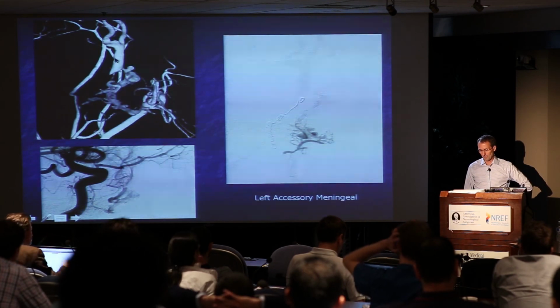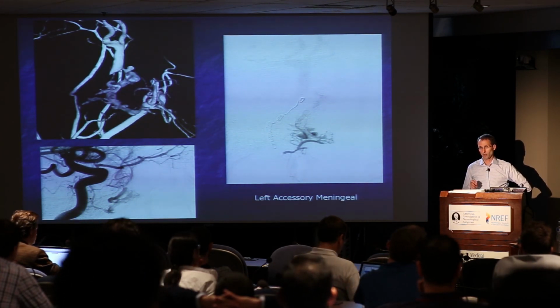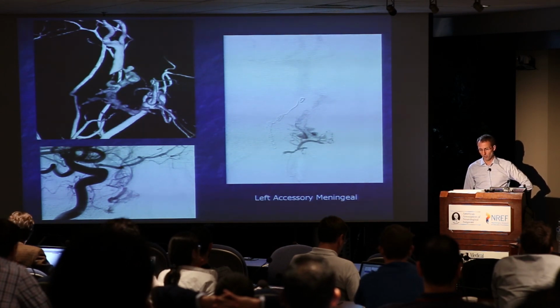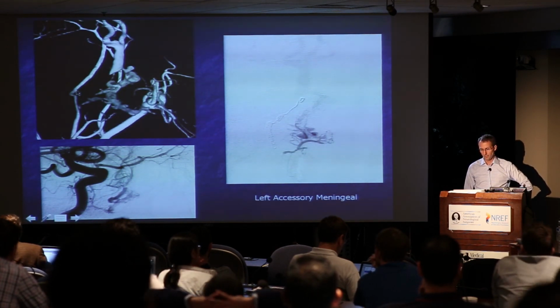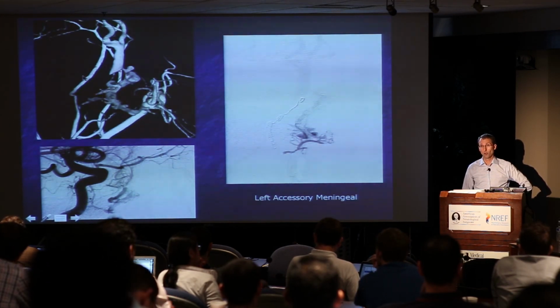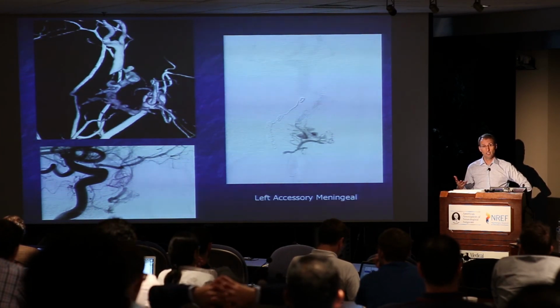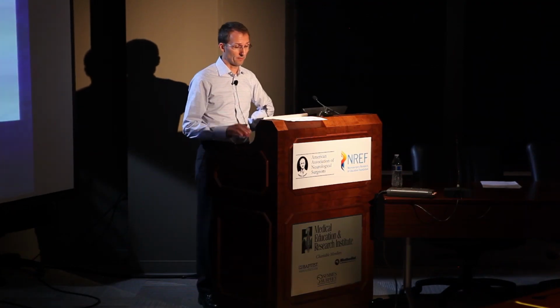We know what the venous outflow is, so we know what our target is, but we're more concerned with the onyx going places we don't want it to go. So hopefully we've eliminated this MMA that we've now coiled off. We still have to realize that there are collaterals that go back to the meningohypophyseal trunk and the ILT into the cavernous sinus. We have to avoid that.